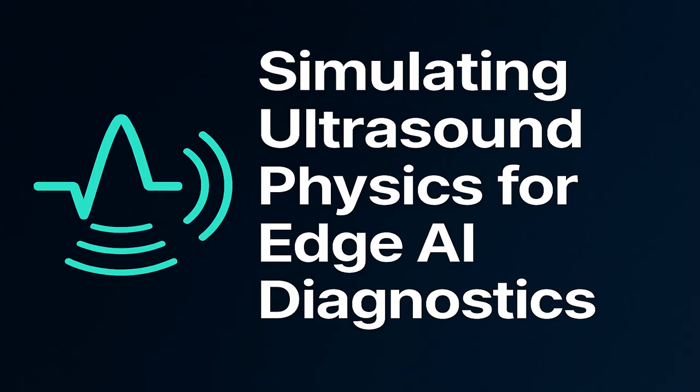Let's give a concrete example of that trade-off because I think it's really important. Okay, imagine you are trying to image a large structure, like the liver, maybe 10 centimeters deep. If you choose a high-resolution 5 MHz probe, the total two-way attenuation would be, let's see, 0.5 times 5 MHz times 10 centimeters times 2 trips. That's 50 decibels loss. 50 decibels. That's a massive amount of signal decay.